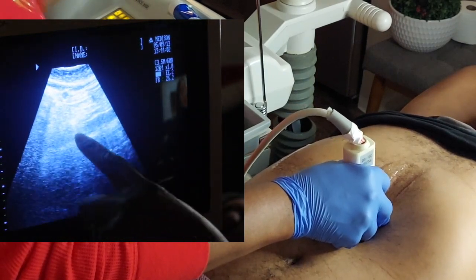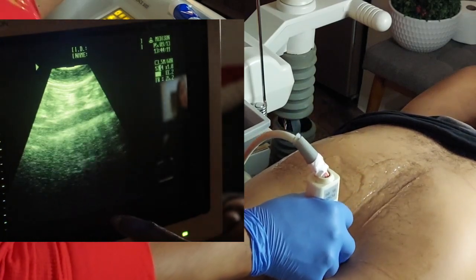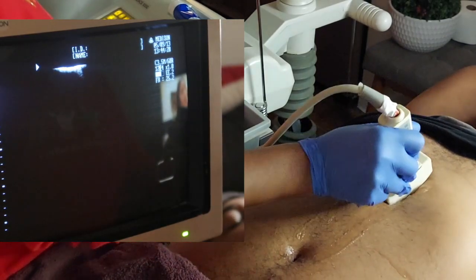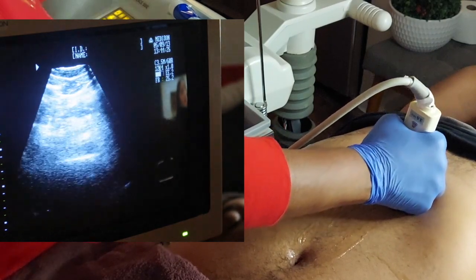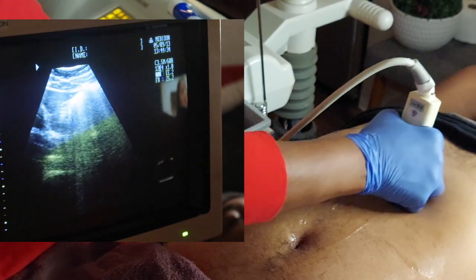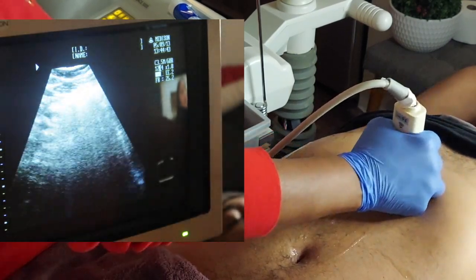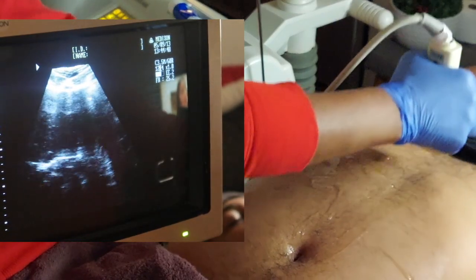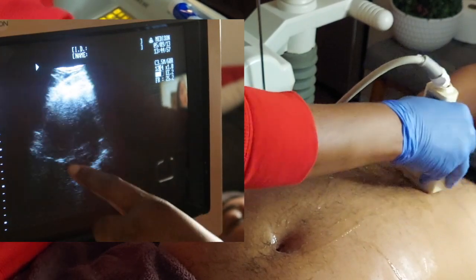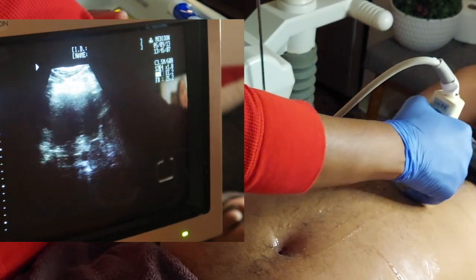And then there's your mid aorta here. I could turn my gain down as well. Mid aorta, and then you're going to go down. And then there's your distal aorta right there. Then after I do that I go back up and turn transverse — so that was in sagittal. Then I turn transverse and get the pancreas. Notice that I'm not able to get the pancreas completely, so I'm going to have my patient take a deep breath in and hold it. Even that may not have cleared it up. Then I'll have him push his stomach out — blowing their stomach out gives you a better window for the pancreas.